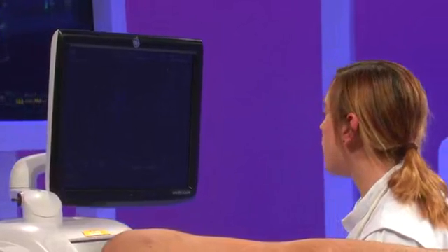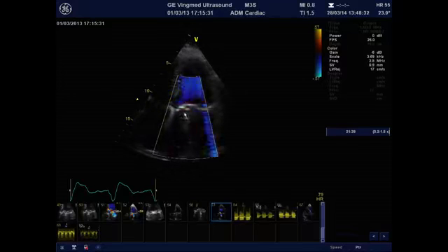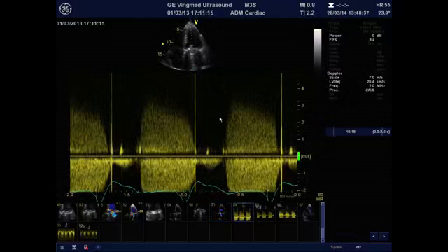When you put the color Doppler flow on that prosthesis, you can note that the diastolic inflow is going through only one orifice, and also there's a lot of aliasing and high velocity. And as we expect, when we interrogate that prosthesis with the continuous wave Doppler, you can clearly see the big envelope. And also you can see here that there's a click missing just for the opening of the prosthesis.